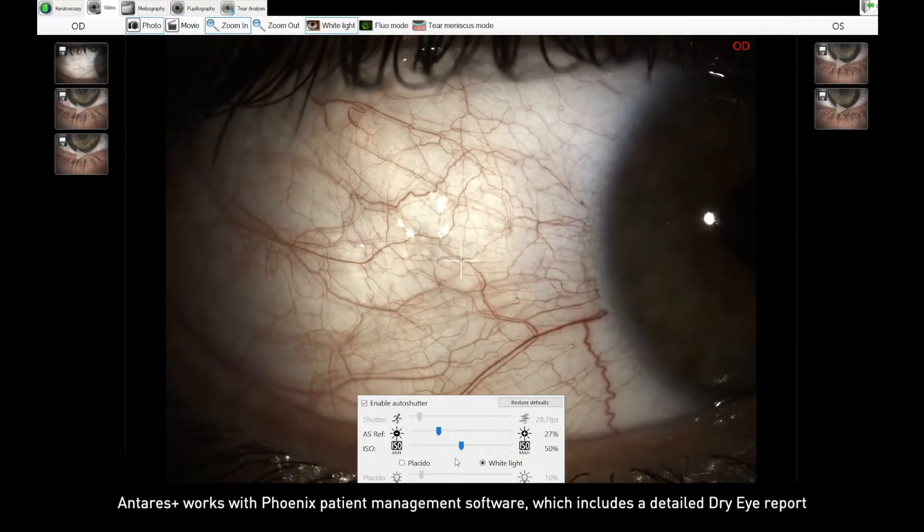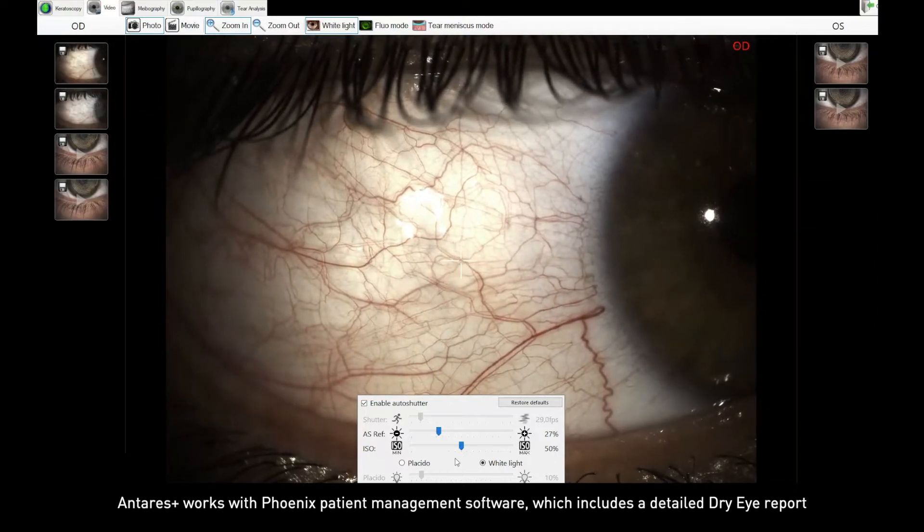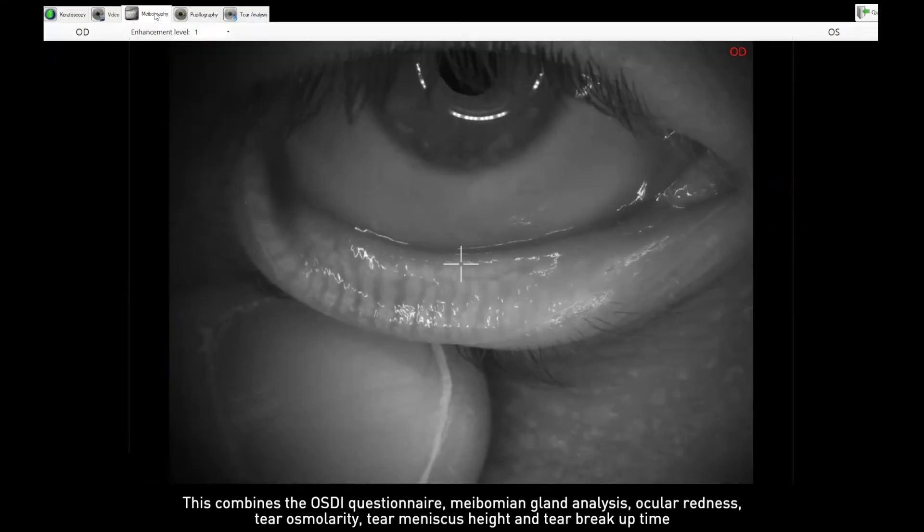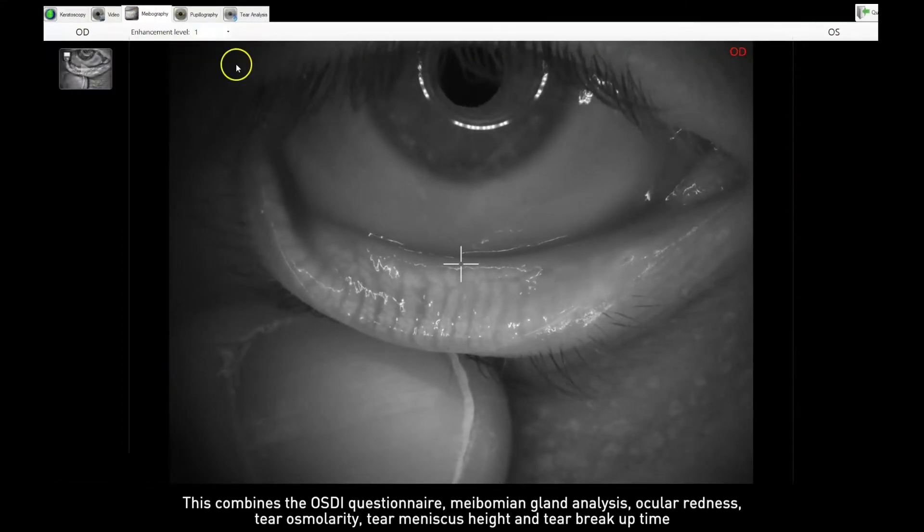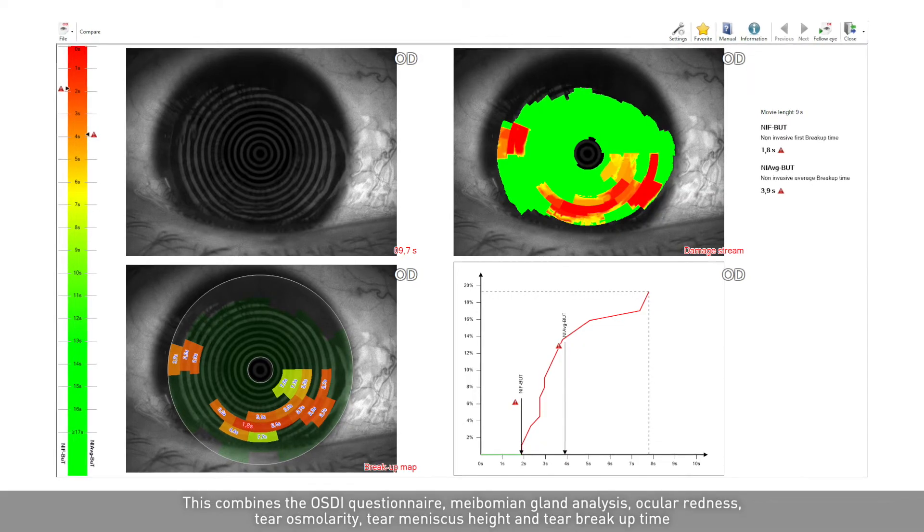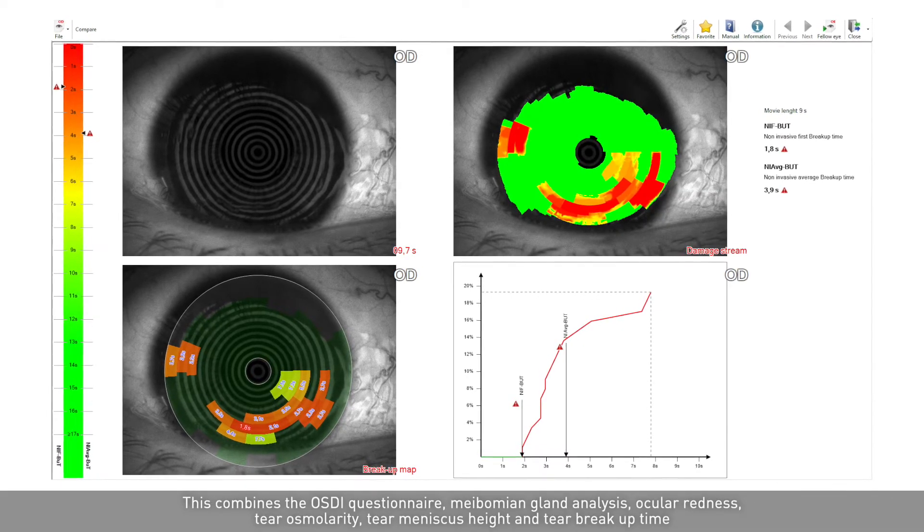Antiris Plus works with Phoenix patient management software, which includes a dry eye report. This combines the OSDI questionnaire, meibomian gland analysis, ocular redness, tear osmolarity, tear meniscus height, and tear breakup time.